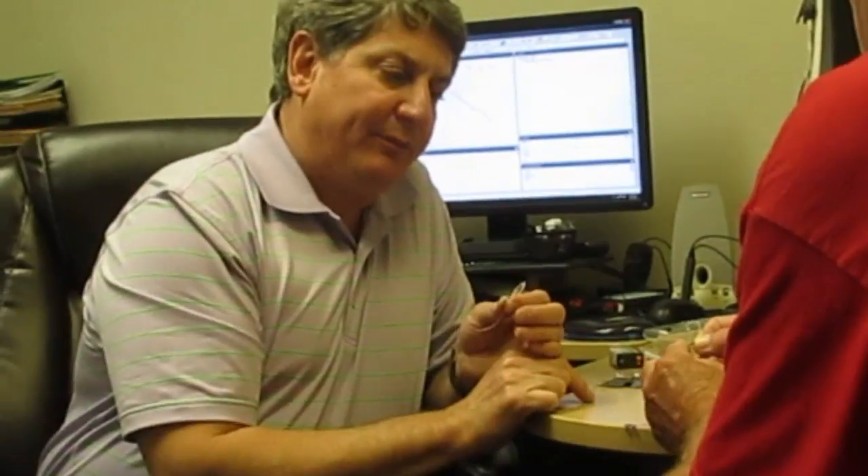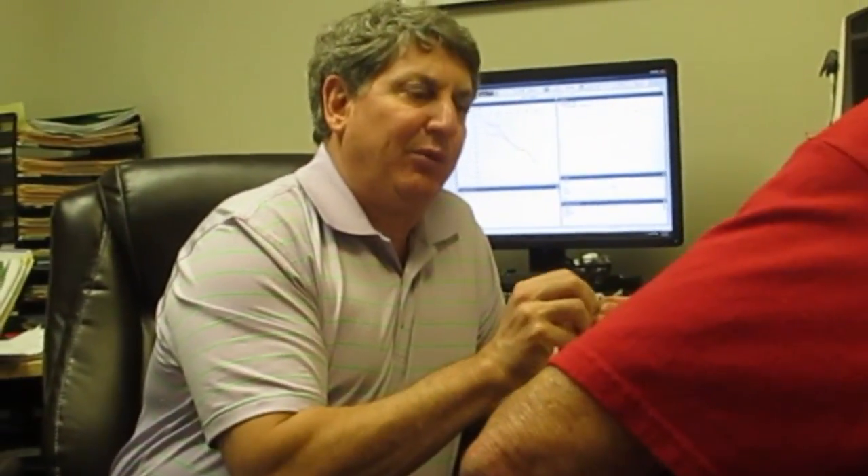That's a little difficult. Press from the top — there you go, you got it. Once you get it, you'll kind of figure it out and it won't give you problems again.